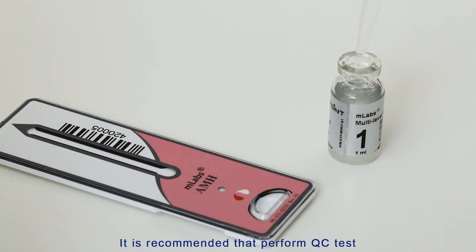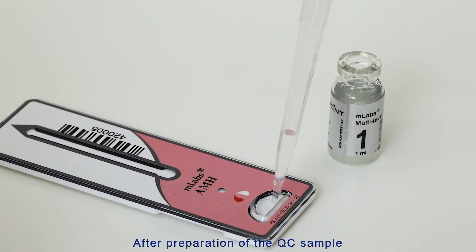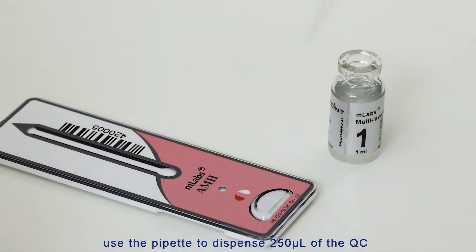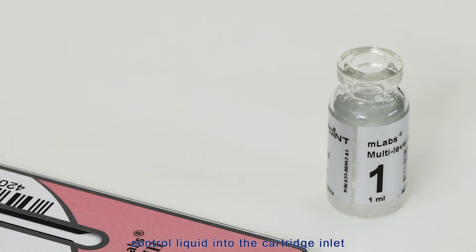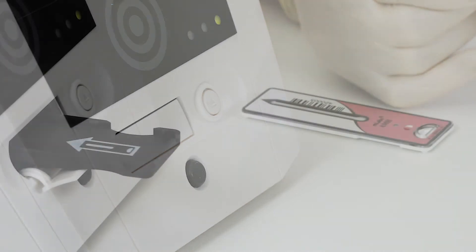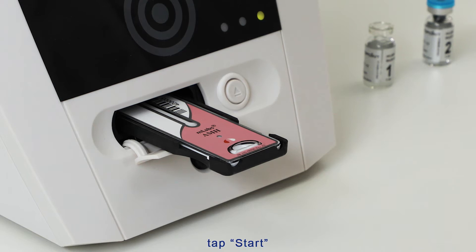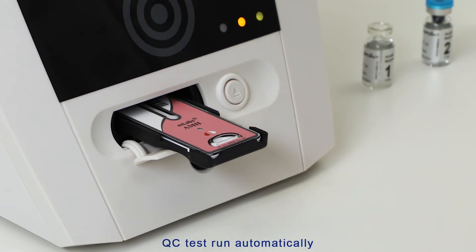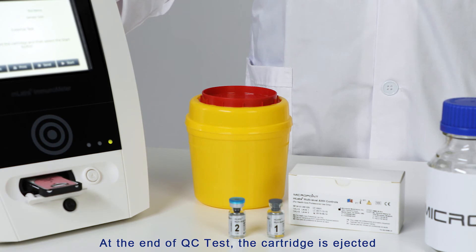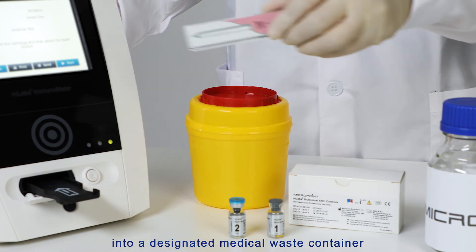It is recommended to perform the QC test immediately after the QC sample is prepared. After preparation of the QC sample, use the pipette to dispense 250 microliters of the QC control liquid into the cartridge inlet. Press the cartridge tray eject button and place the cartridge into the cartridge tray. Tap Start — the QC test runs automatically. At the end of the QC test, the cartridge is ejected. Discard the used cartridge into the designated medical waste container.